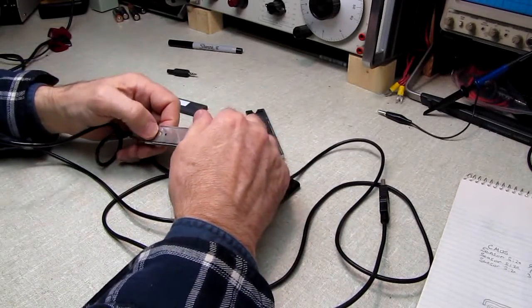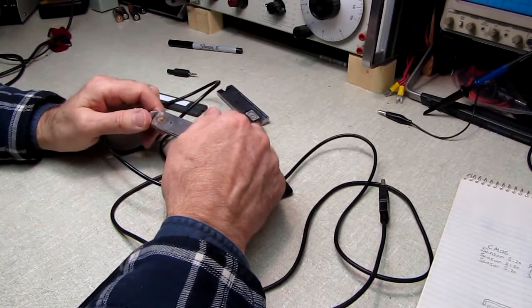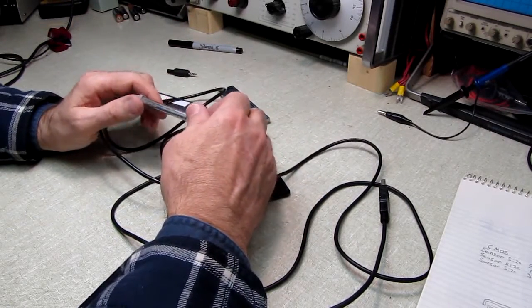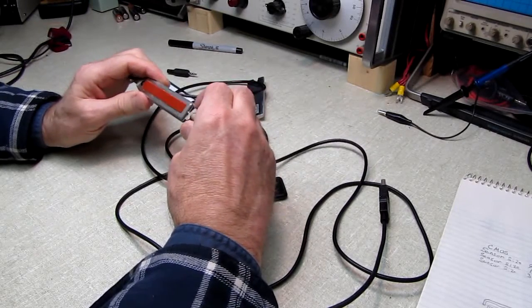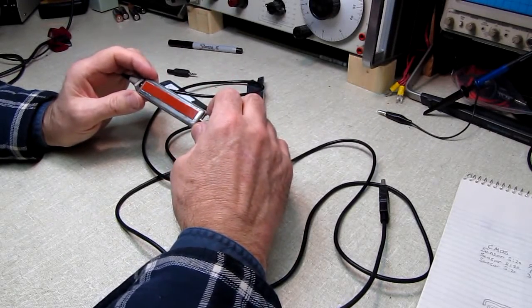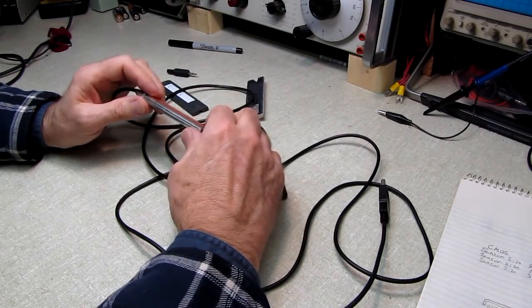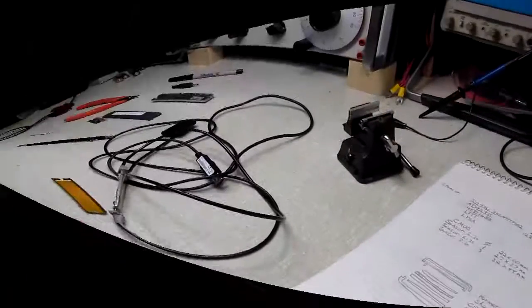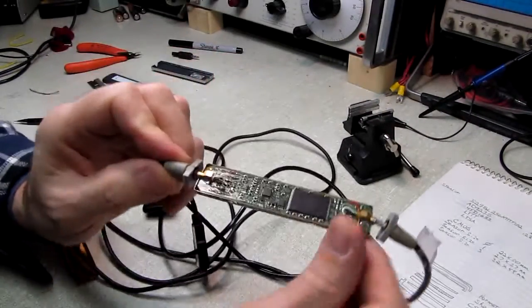There's a push button here for remote control. There's a little rubber button right there, but this is completely enclosed in a metal can. I'm assuming they do that so that the x-rays don't affect it. This is going to take a couple minutes. We're going to do a time shift. Well, there we are. Through the magic of digital editing, we are back.